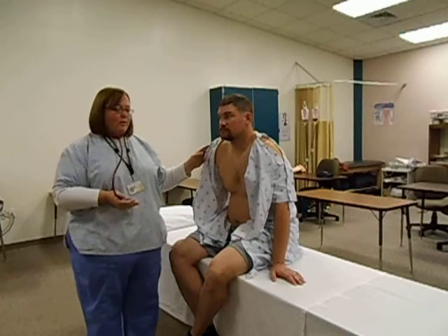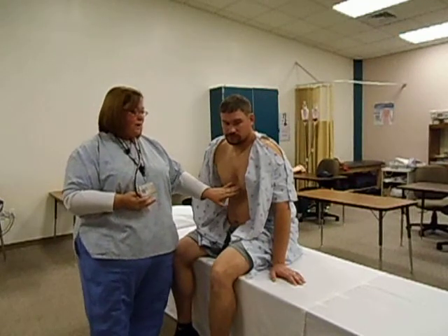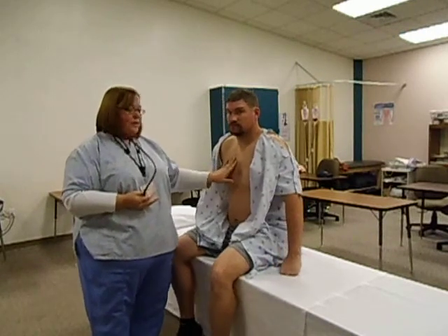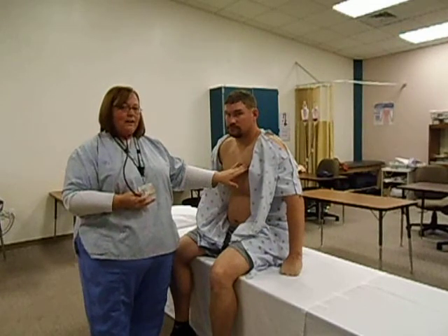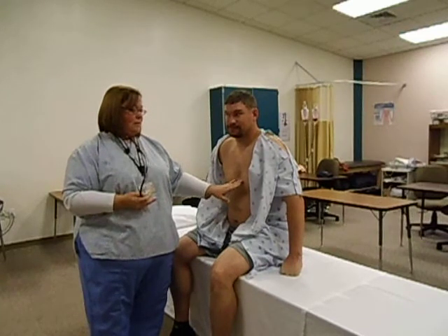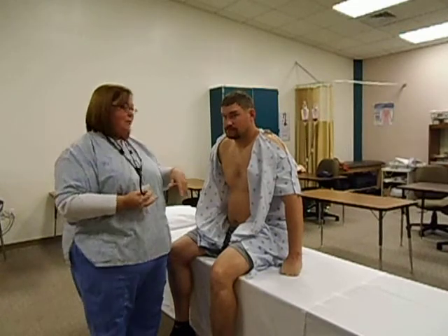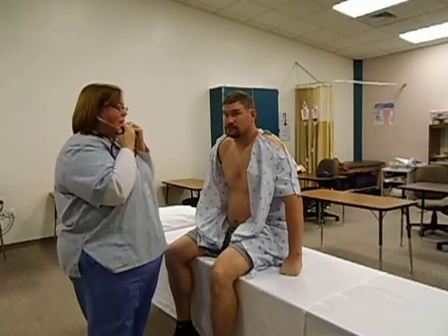We are now going to auscultate the valves of the heart. We're going to begin with the aortic, excuse me, the pulmonic, go to Erb's point, followed by the tricuspid, and then the mitral. The aortic is the right second intercostal space, the left second intercostal space for the pulmonic. Erb's point moves down to the third intercostal space, followed by tricuspid at fourth, and the mitral in the fifth. We'll be doing this in 3 positions, in the sitting, supine, and the left lateral recumbent.